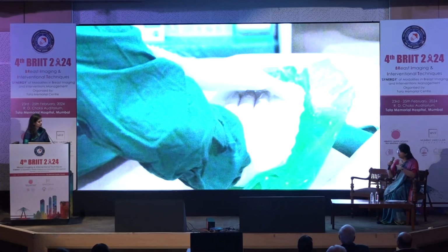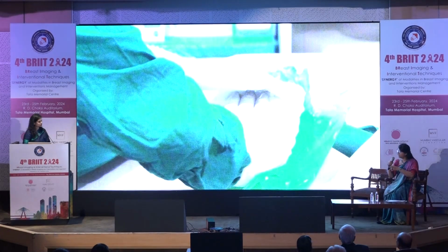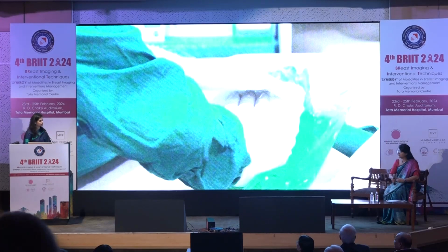Okay. And after the RAD path or at any point, do you have a follow-up MRI? Yes, only if there is a RAD path discordance. We would call it a RAD path discordance if it is reported as a 4C or a 5, then we might want to re-intervene rather than put it on surveillance. But if it is a 4B and we are worried about it, it is negative and well targeted, we would still ask our patients to be on closer follow-up with an MR until the stability period is achieved, and then the patients can be off the follow-up.